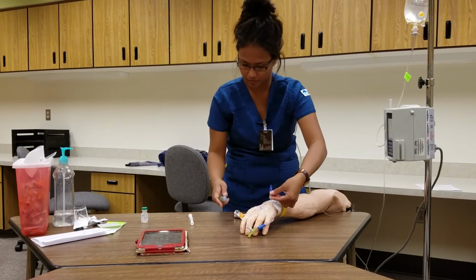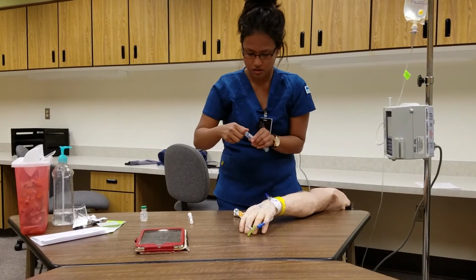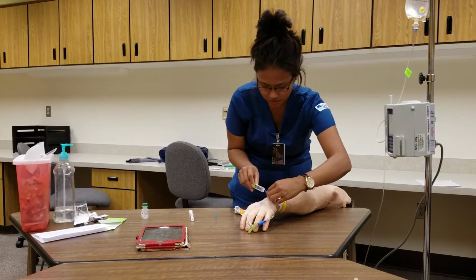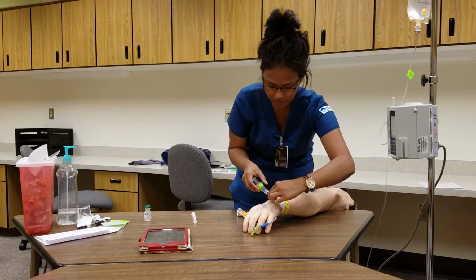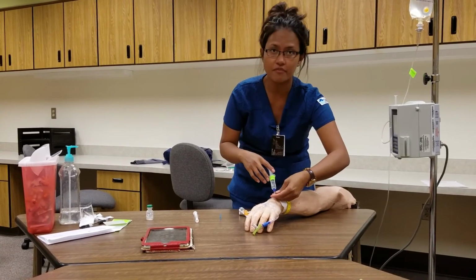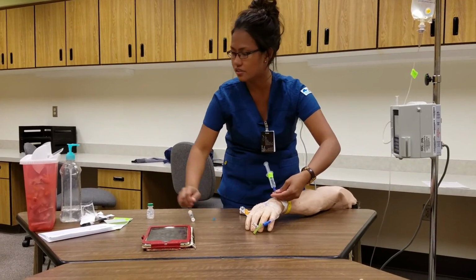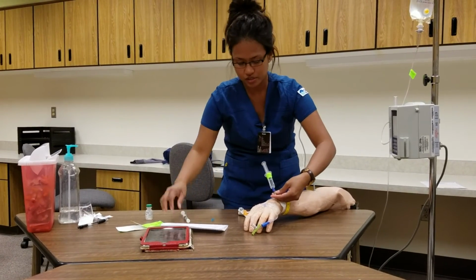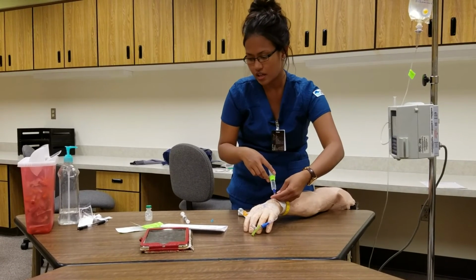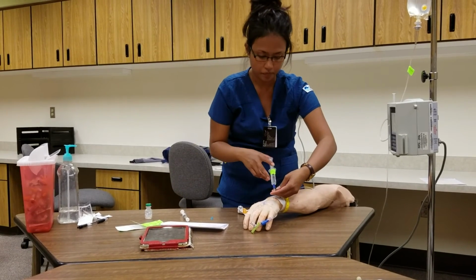Okay, so I'm going to inject the morphine sulfate to my patient. I'll be infusing it at least around 2 to 5 minutes slowly. I want to document the time that I started, so I'll be documenting on my paper. Let's say it's 2 o'clock right now. So I'm slowly injecting it. And let's say after 5 minutes, I'll also be documenting the time that I stop.